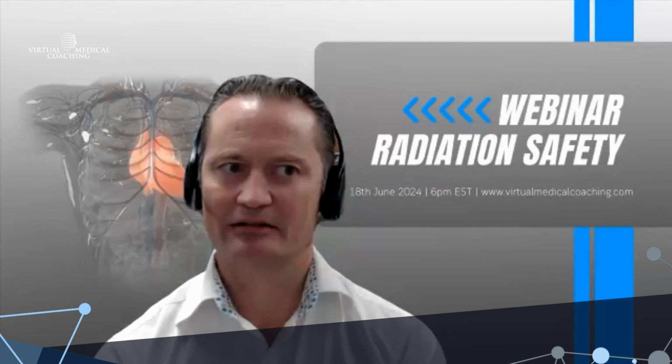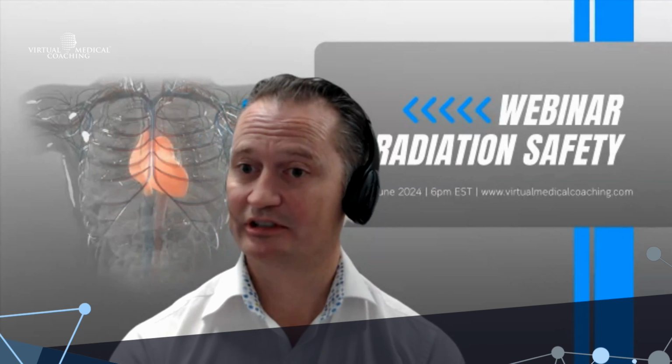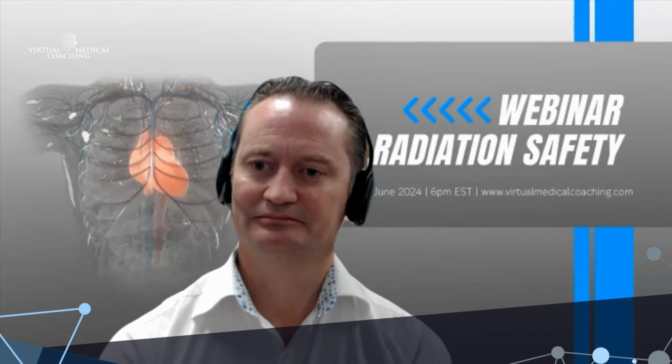Cool. And when you say you're relaxing a bit on the shielding, is that with your patients being shielded? Yes, not as radiographers, as patients. Essentially, the relaxing is if a patient is going to be moving and things of that nature, and we use the shield in the anatomical structures of interest. Of course, we don't want to get the shield in the way because then we have to repeat the exposure and the patient gets double the dose as well. But we always have the radiographer use the shielding whenever they're in the room with patients during OR procedures.